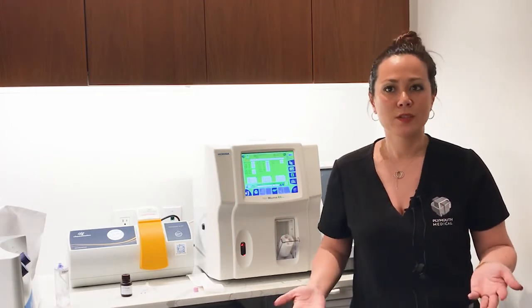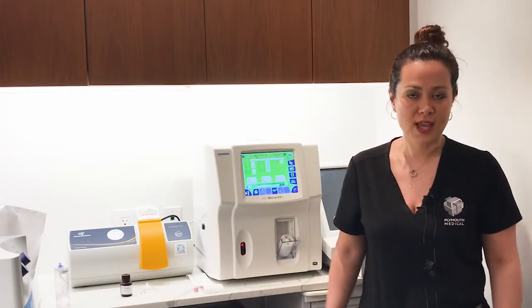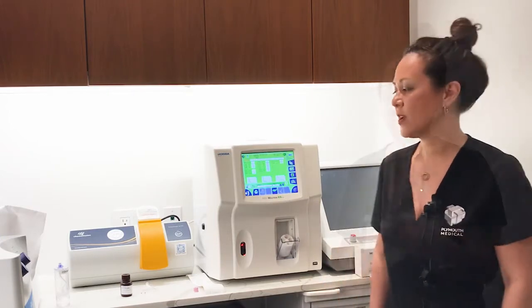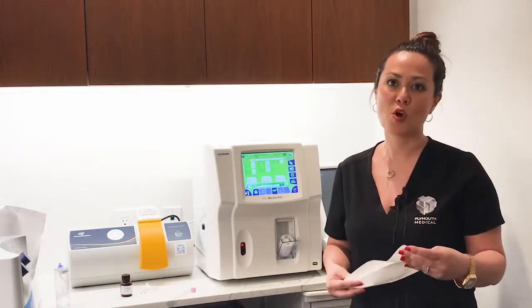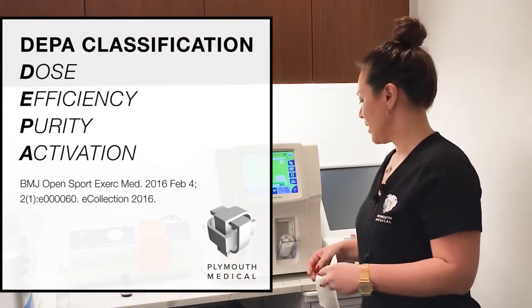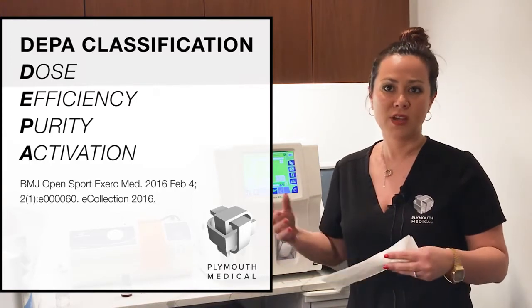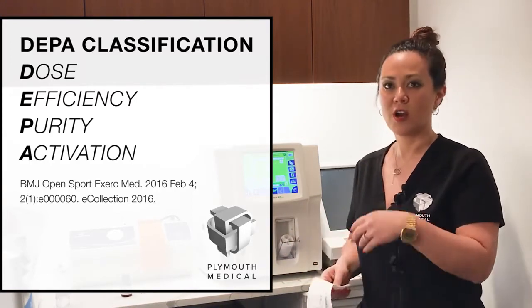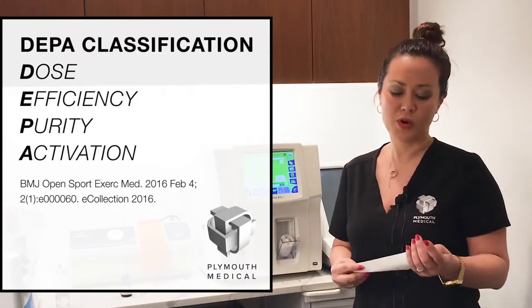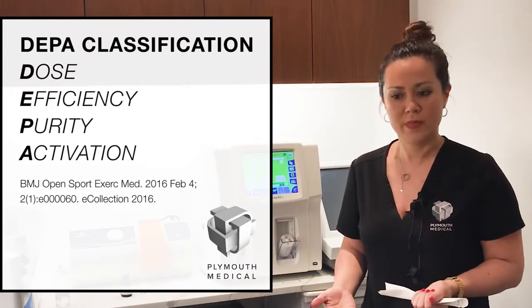There's no need for dilution, which just further complicates quality control and cell counting at the point of care. As you know, platelets when they come in contact with plastic or air do tend to degranulate, and therefore it's very important when you're doing point-of-care platelet counts to use the right equipment.